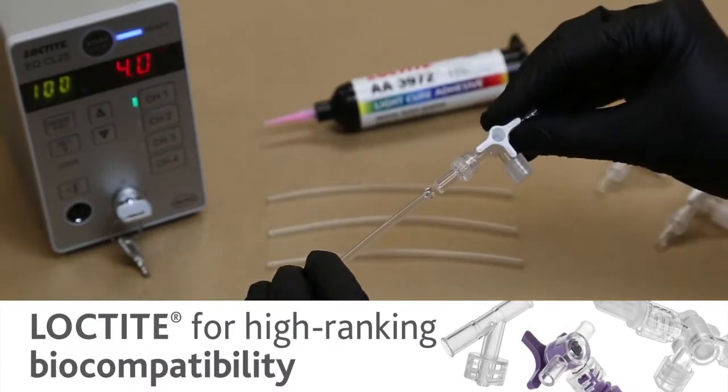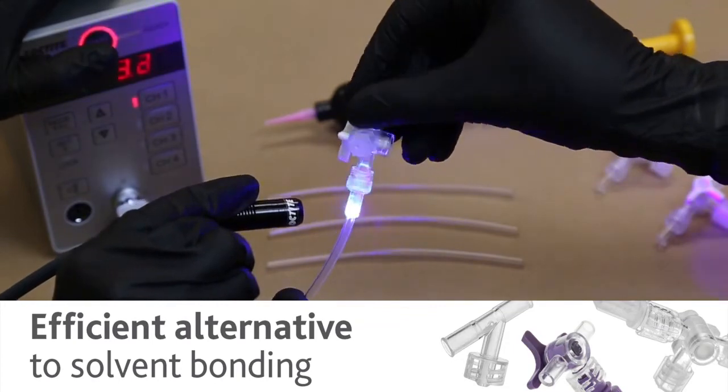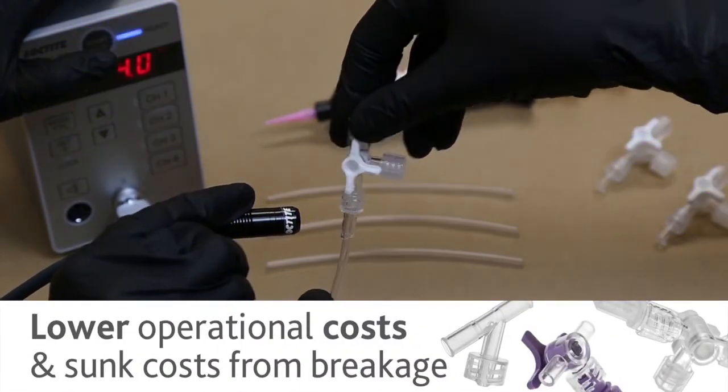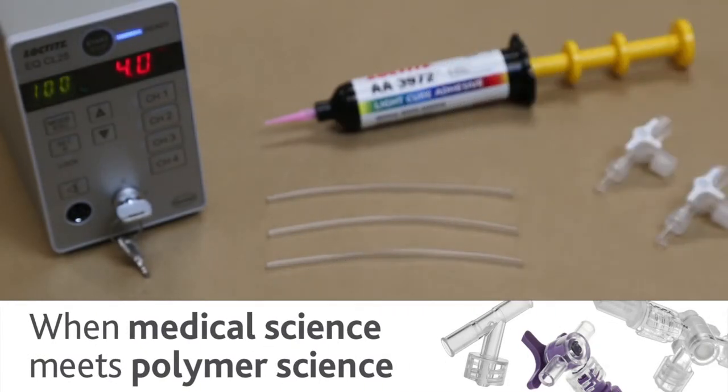Loctite ranks highest among industry biocompatibility standards, offers improved curing and increased flexibility, and can lower operational and sunk costs, making it a perfect match to the proven quality, strength and durability of Triton.